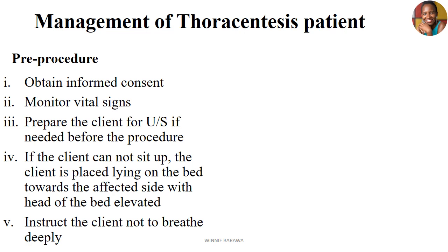So how do we manage a patient who is undergoing thoracentesis? Here also we have the pre-procedure and the post-procedure management. The first part of pre-procedure is to explain the procedure to the patient and obtain informed consent. And of course, monitor vitals and ensure they are stable before we send this patient for the procedure.